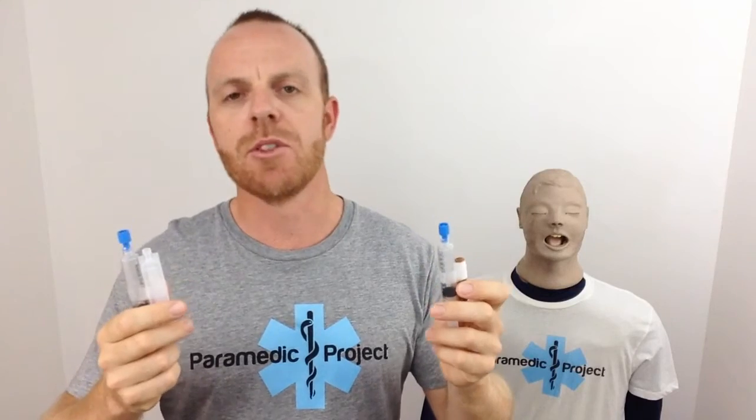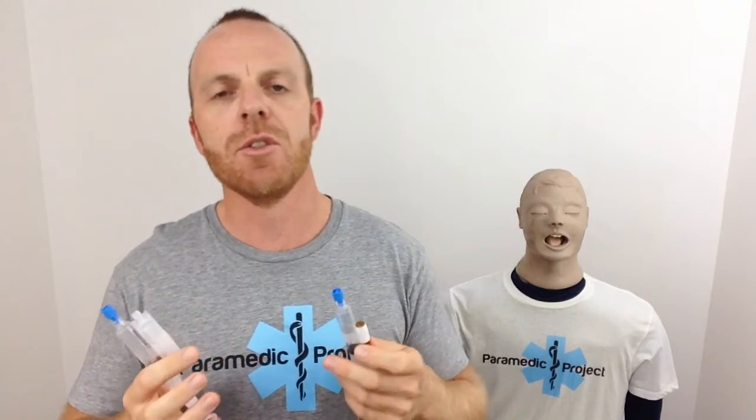Second big point is the concept of labelling syringes. Now, in my experience, to avoid drug errors, every single syringe, every single drug, whether that be a flush or any other type of drug, whatever's in that syringe needs to be taped to the syringe. That's the easiest way to label it. And if it's been double diluted, then we need to mark the syringe really clearly and actually write the drug on the syringe with a permanent marker. And that includes the actual amount of drug that's in the syringe. So that's a really important point.